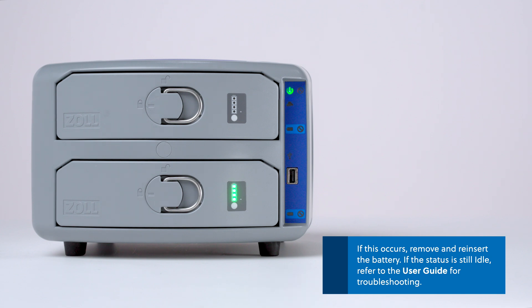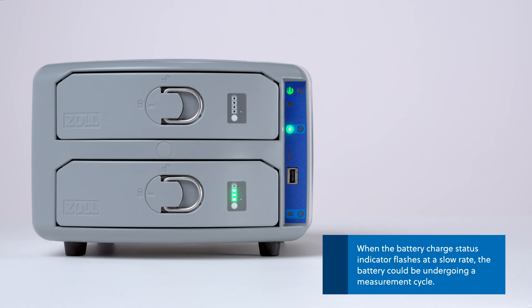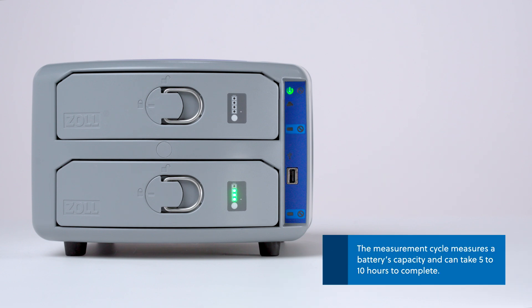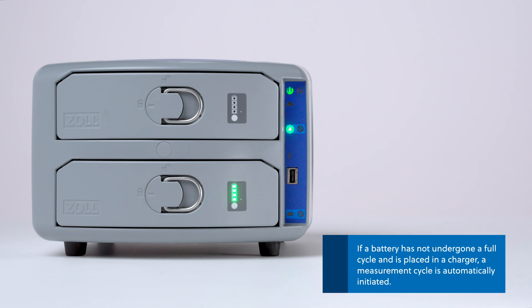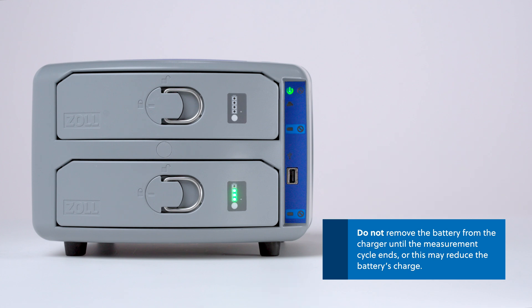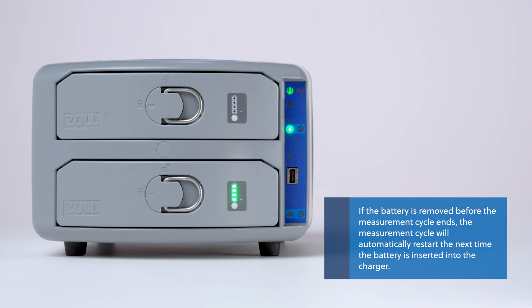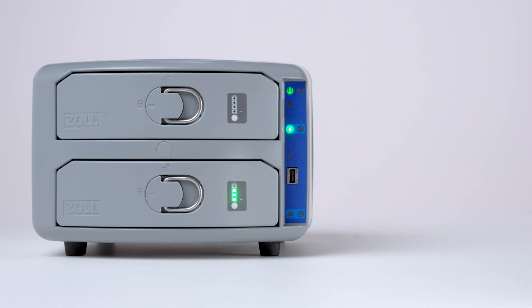If the battery charger is unable to recognize the battery, remove and reinsert the battery. If the status is still idle, refer to the user guide for troubleshooting. When the battery charge status indicator flashes at a slow rate, the battery could be undergoing a measurement cycle. The measurement cycle measures a battery's capacity and can take 5 to 10 hours to complete. If a battery has not undergone a full cycle and is placed in a charger, a measurement cycle is automatically initiated. Do not remove the battery from the charger until the measurement cycle ends, or this may reduce the battery's charge. If the battery is removed before the measurement cycle ends, the measurement cycle will automatically restart the next time the battery is inserted into the charger. After the measurement cycle completes, the battery is ready to use, and the battery charge status indicator on the charger panel will illuminate.